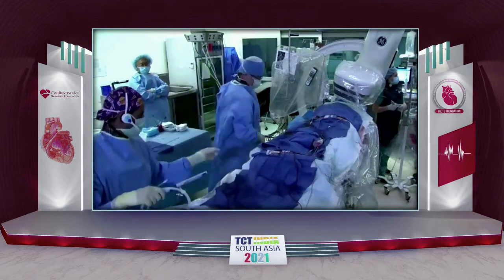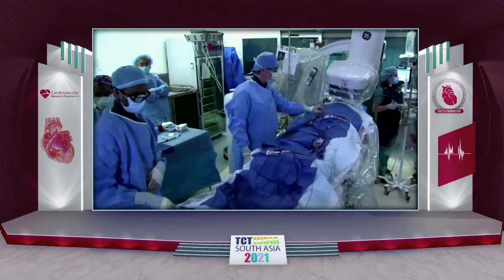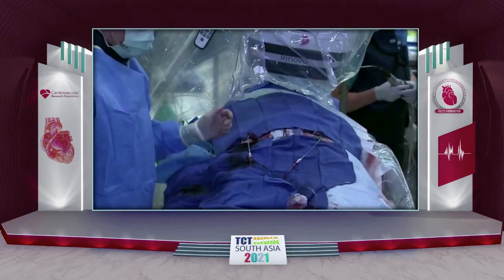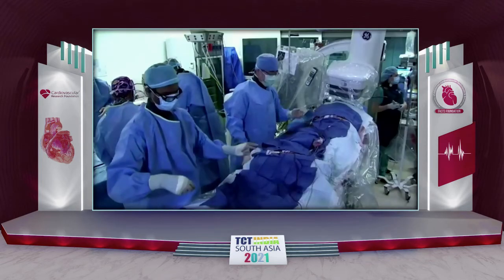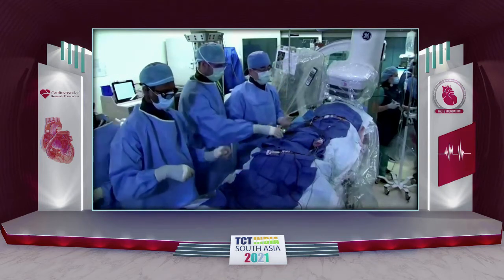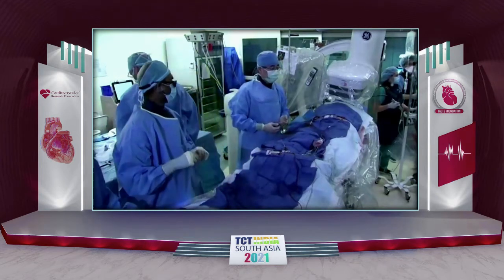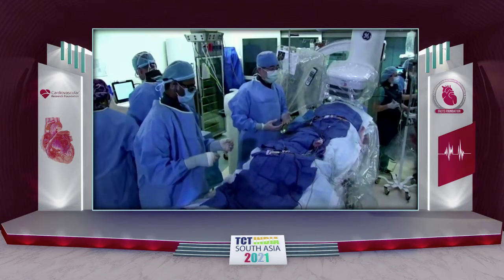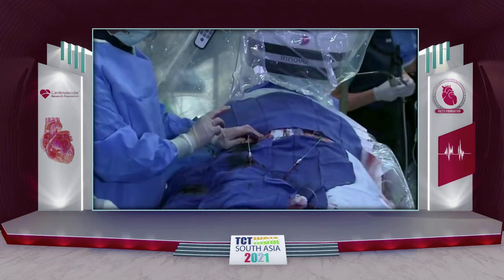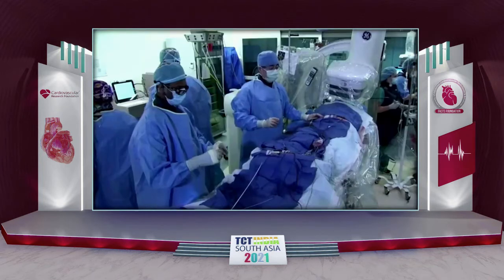What is the routine? You're closing your strategy? You close with Perclose or you use a Manta device? I usually use 2 Perclose in here in the pre-deployment, and it depends on how things go. This patient's vessel caliber is pretty large, so even with the 2 Perclose with therapeutic heparin, it's probably going to see the leak, almost like an aortic leak, just a pulsatile flow. My personal way to do these things, I don't chase perfectionism for these 2 Perclose. If you are perfectly able to get hemostasis, fine, fantastic, we'll take it.